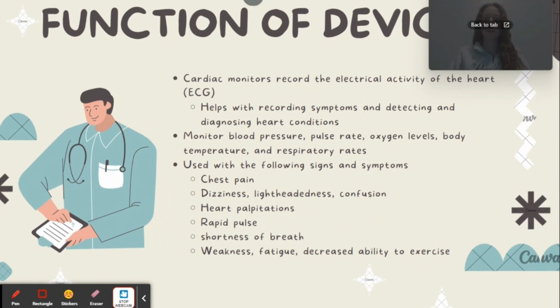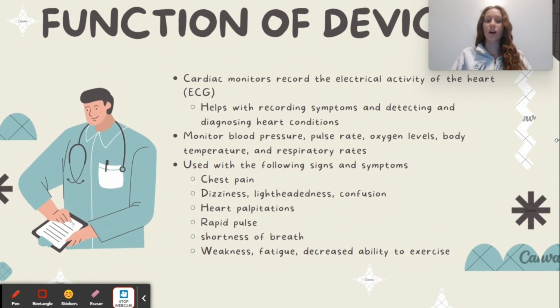So the functions of the device are that the cardiac monitors record the electrical activity of the heart, so like an ECG. They also help with recording symptoms and detecting and diagnosing different heart conditions. They also monitor blood pressure, pulse rate, oxygen levels, body temperature, and respiratory rates.